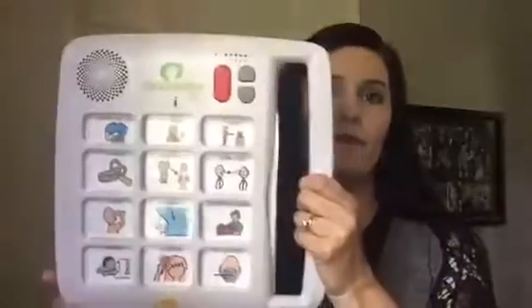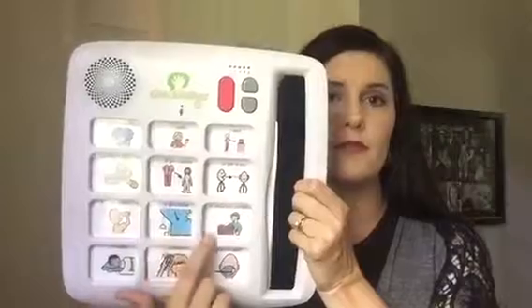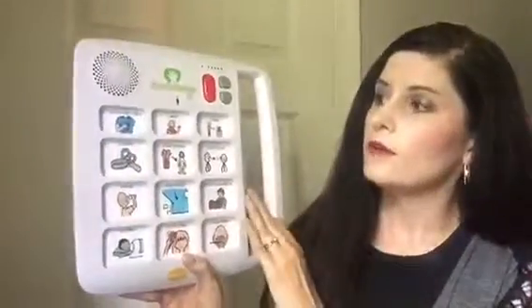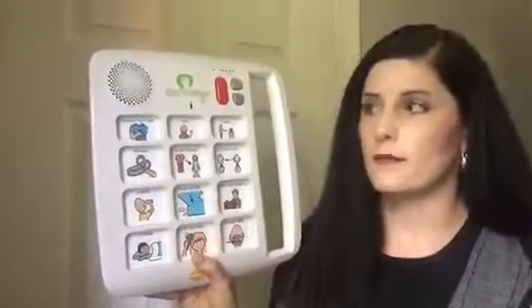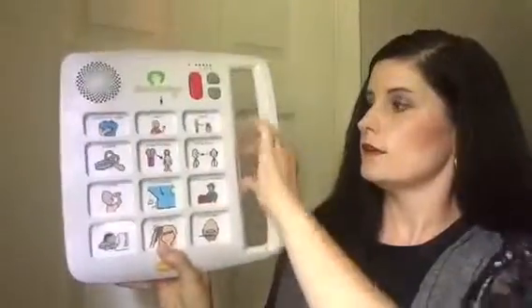Then as she got older, we were able to qualify through a grant for something like this called a Quick Talker. It's the same idea. You still have the Boardmaker software, the pictures that represent things that she would like to do. This is when we started encouraging her to put together a sentence. Please, may I have a snack? We could program this any way we would like, and we tried to put it in a format where she would have to put two buttons together to request something and to make a sentence. Again, we used Boardmaker, and over on the side here, the little pages would slip out and we could put a whole new board in here.